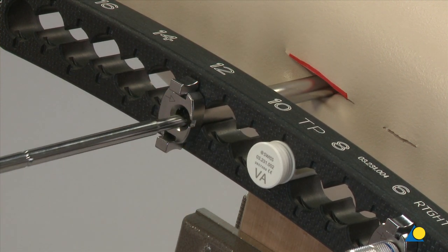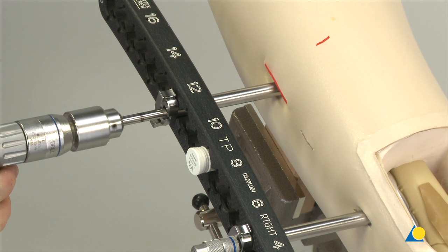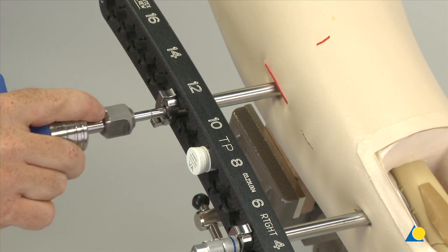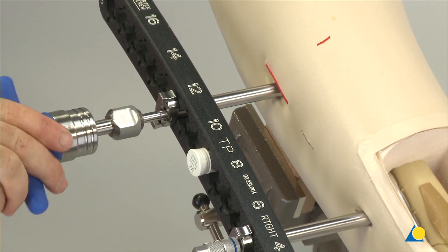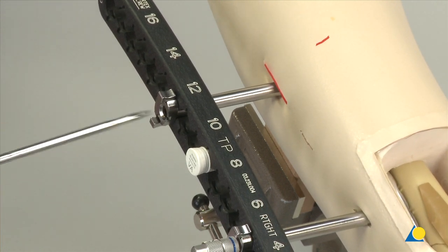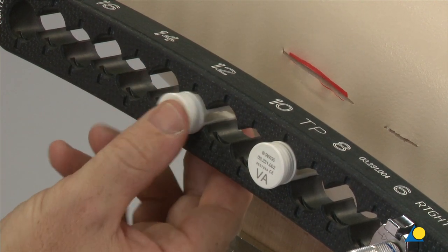Insert the corresponding length variable angle locking screw. Final tightening must be done by hand using the T25 star drive screwdriver shaft and the T-handle with torque limiting function 6 Nm. Remove the guide sleeve by depressing the release mechanism. Mark the screw location in the aiming arm using a stopper.